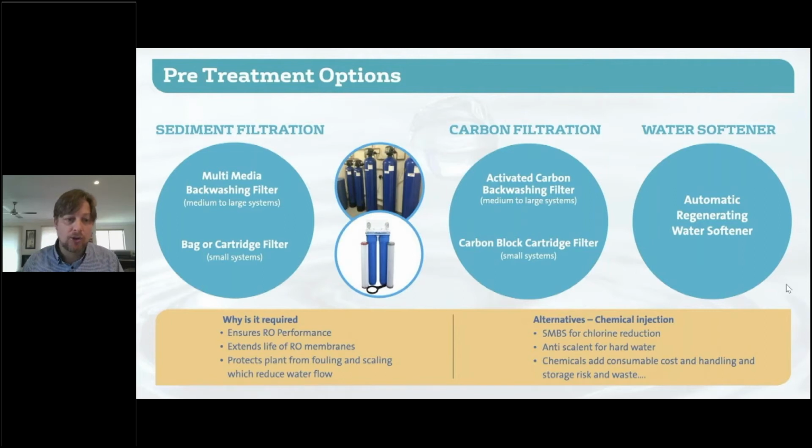Really, it's to look after the RO. It protects the membranes from fouling, from hardness minerals, or from degradation from chlorine, or fouling from organics or solids in the water, all of which reduce the efficiency and performance of the RO. So that's why it's important.